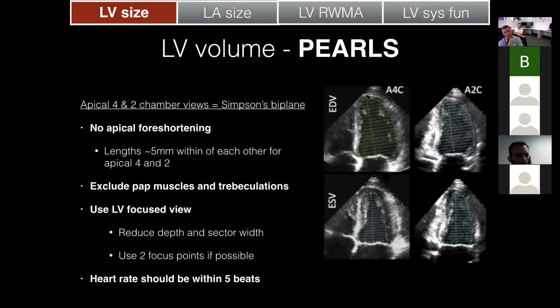Okay, so I think it's really important. And maybe the last thing I'll say is I find it quite tricky sometimes to trace the inside of the endocardium and know exactly where it is. One of the things that's really tricky is sometimes the trackball. When you're tracing these things out, if you're looking at your cursor, that's how you can make errors. What I'm actually doing is not looking at my cursor. What I'm looking at is about 3 centimeters further on. So my cursor goes where my eye follows.